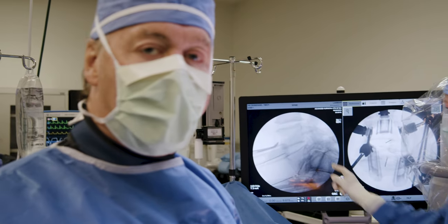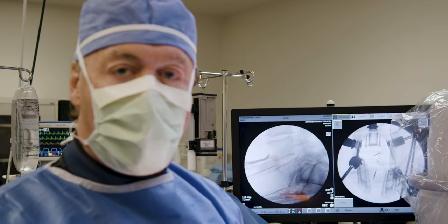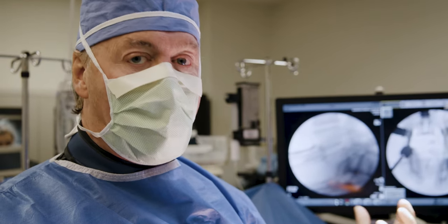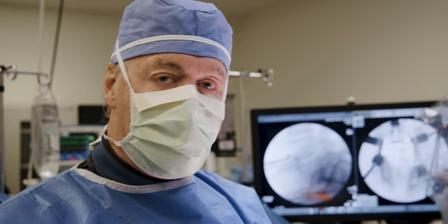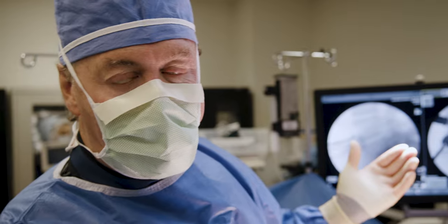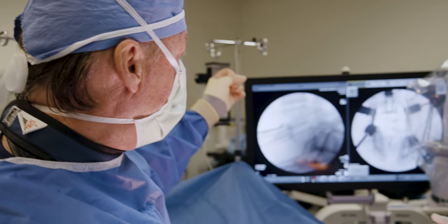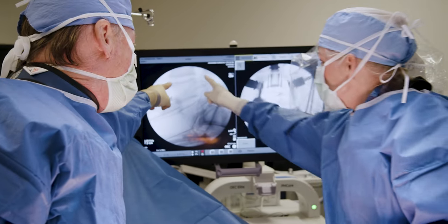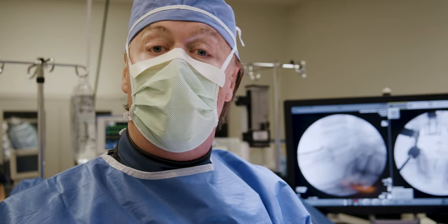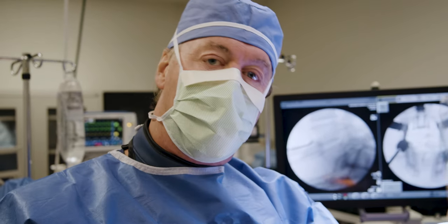Because the facet joints are normal at the top two levels, we're going to do artificial disc replacements there. He's actually a friend of mine — we were surfing in the Arctic Ocean together north of Iceland — so he wants to keep mobility of his spine and reduce pain. I'm not going to fuse the entire spine; I want to maintain motion by placing artificial discs at L3-4 and L4-5. At the bottom, because the joints are broken, we have to fuse — so this is a hybrid: a combination fusion with disc replacement.